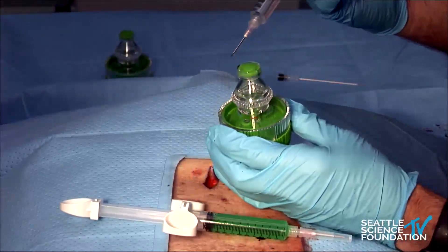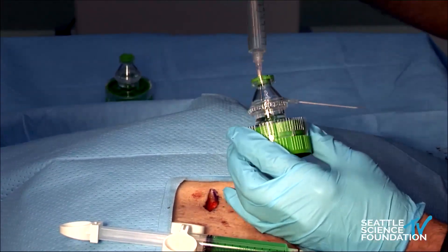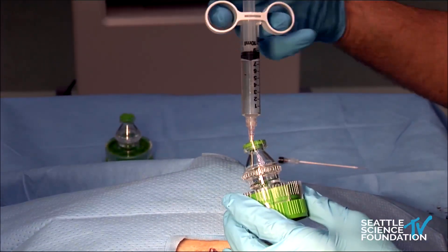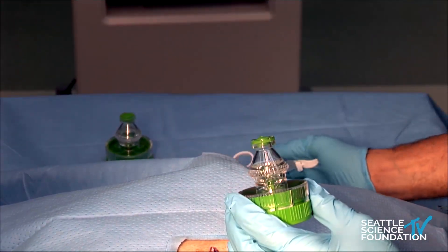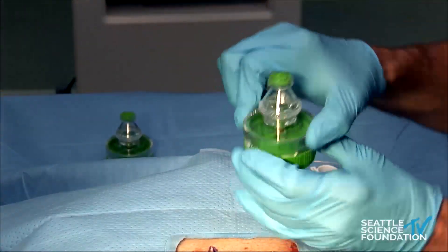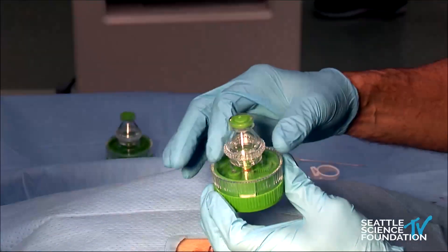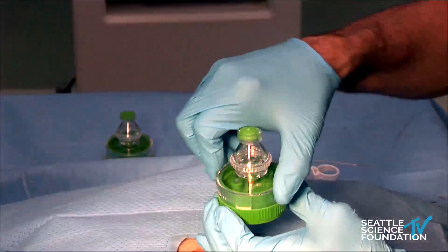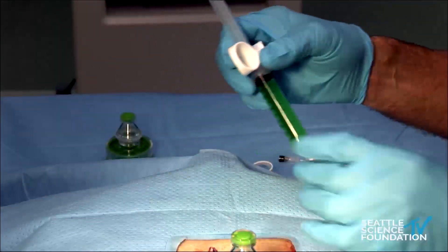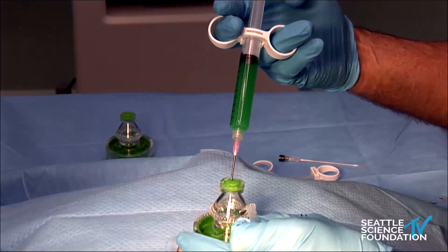The first step is adding one cc of saline, which is injected into the container. Then mixing occurs for 30 seconds using a rotary mixer — the bottom part contains gears and the top part is a container holding the combination of micronized disc material and saline.